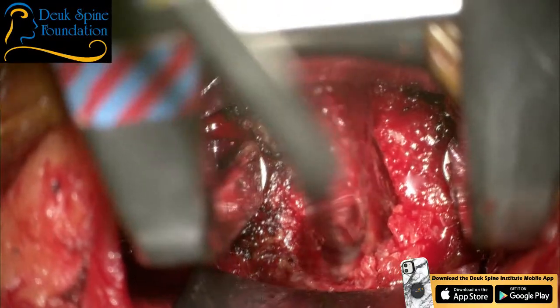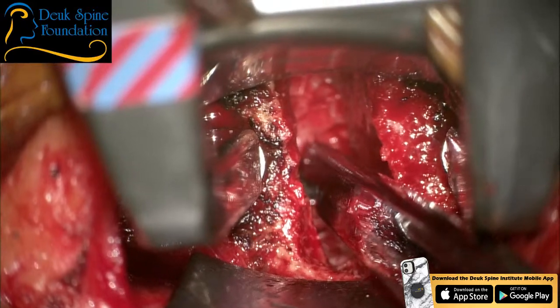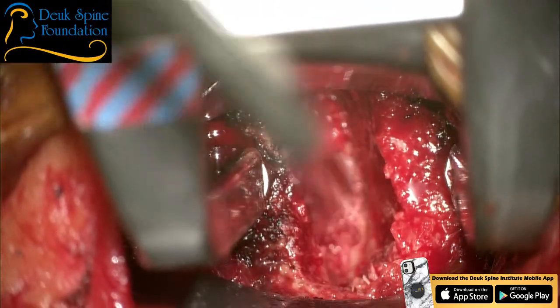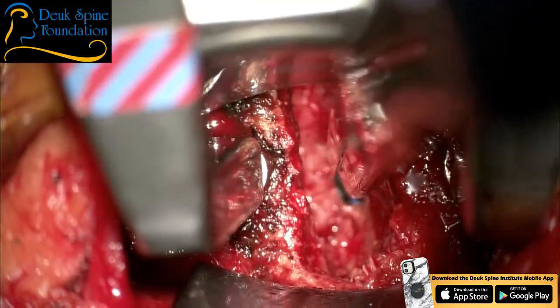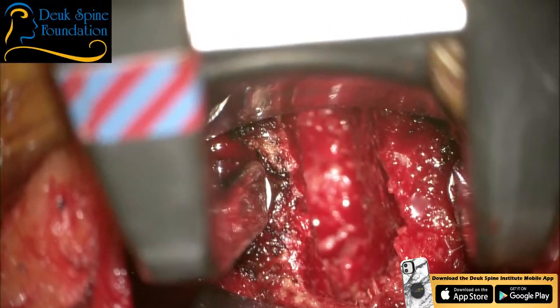This is, the nerve is being crushed right here. Absolutely crushed. So we're uncrushing it. And I'm using what's called the Kerrison rongeur to do that. Kerrison, K-E-R-R-I-S-O-N. Good job, Dr. Patel.